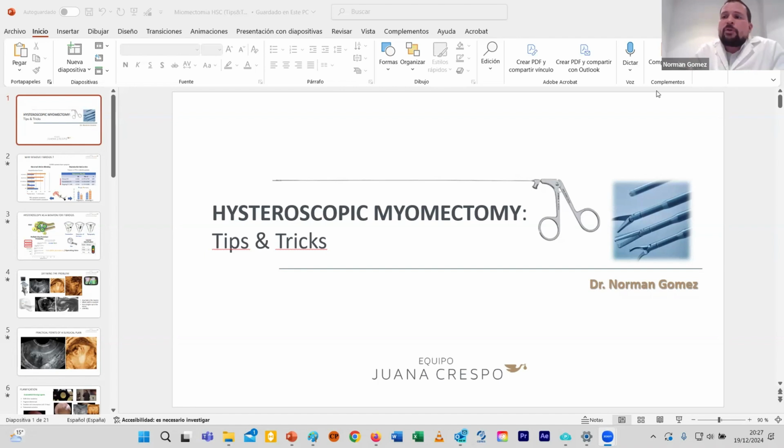But sometimes I approach cases because you are always in contact with the fibroid. When you localize the pseudocapsule very well, you stay always in the pseudocapsule. I also on some occasions have 3 millimeters in one part of the fibroid, but this is a matter of experience. All right.